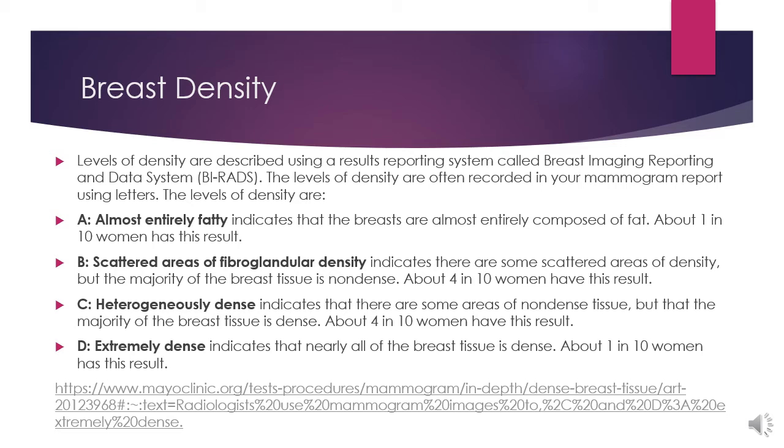At this point, there are some doctors who would recommend the patient go for a further MRI just to rule out any abnormalities that are hidden within that fibroglandular tissue.